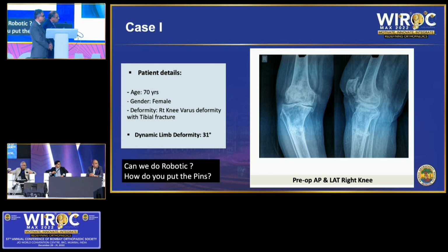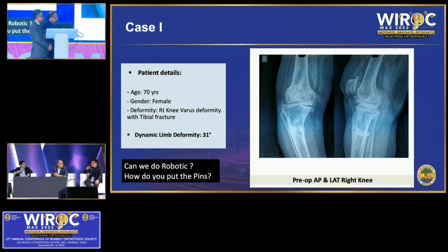If it's a mobile deformity, put an external fixator, align it, then do the pins, then do the cuts, then put an intramedullary rod in, and then you can come out. You can put an X-fix, 2 pins on the bottom. I think when they are mobile, that doesn't mean that they are very mobile like a fresh fracture. They are correctably mobile. Or you can osteotomize the area and put an X-fix and then go and do the cuts.